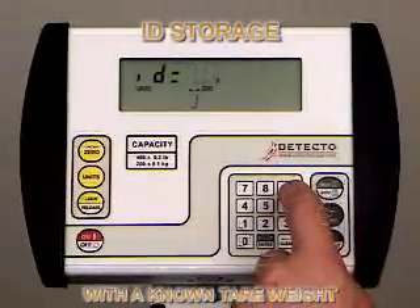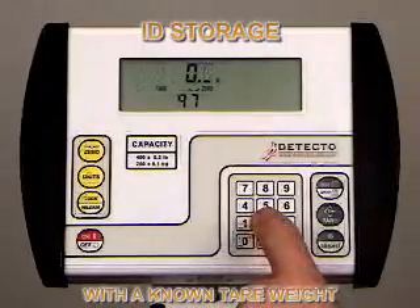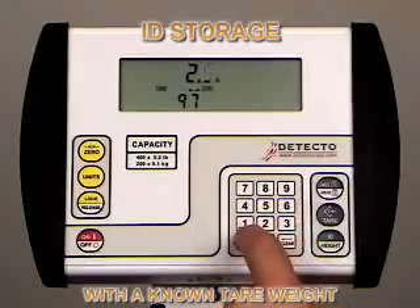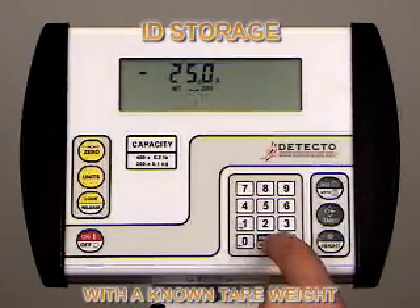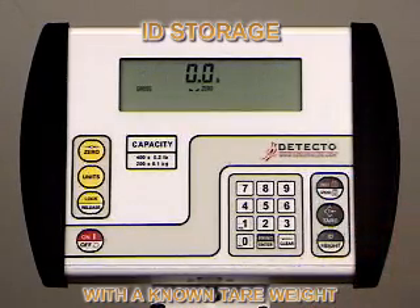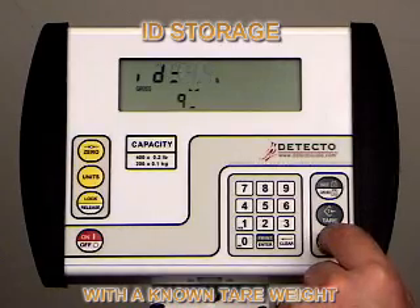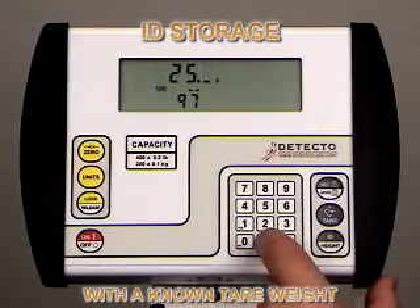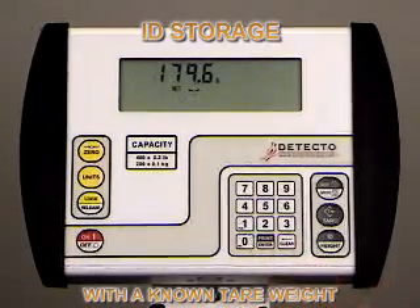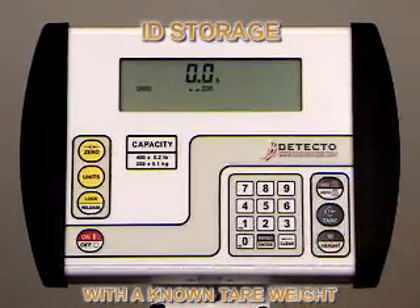For ID storage with a known tare weight, press the ID height key. The display will change to show ID. Using the numeric keys, enter the ID number — in this case, we're using 97. Press the enter key. The display will show 0.0 and the tare annunciator will turn on. Use the numeric keys to enter the known tare value. For illustration purposes, we're using a wheelchair with a weight of 25 pounds. The weight display will show the negative net weight as long as no weight is on the scale. Press the gross key to return to normal weight mode. To recall the ID while a patient is being weighed in their wheelchair or walker, press the ID height key and the 758C will show the last ID entered. Pull up the value you want — in this case 97 — then push the enter key. The indicator will go into tare mode displaying the stored value. If that is acceptable, press the enter key. The indicator will go into net mode, showing the patient's weight only of 179.6 pounds without the weight of the walker or wheelchair. When they are removed from the scale, the negative net weight from the stored ID is displayed and can be zeroed out by pressing the zero key.